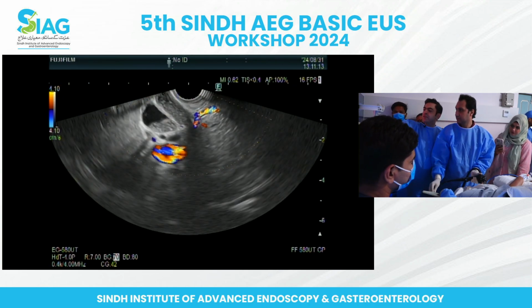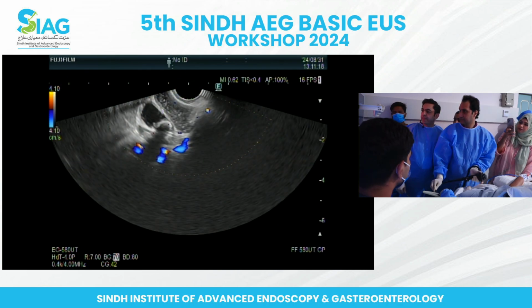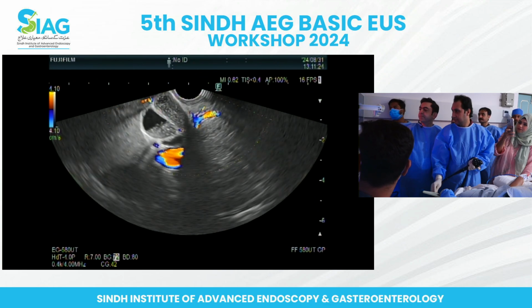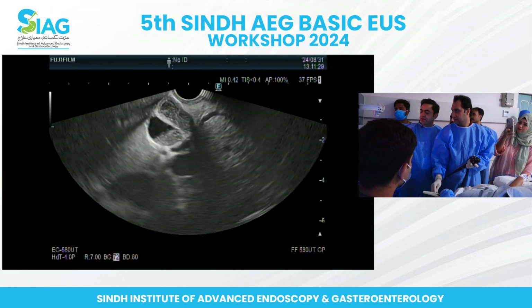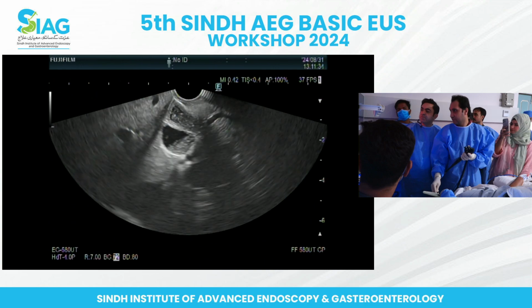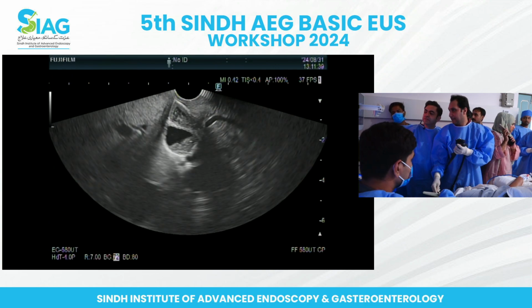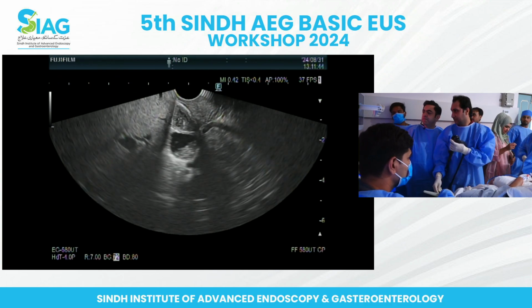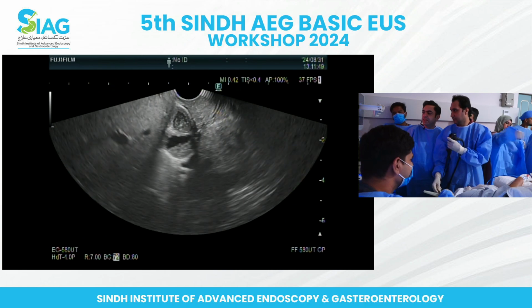Okay, so just follow the bile duct. Let's see if you can trace it all the way down. Khalid bhai, you were saying something? You're looking at it and just need to make sure that it's a bile duct or a gallbladder. So let's just follow it from the top to the bottom. Let's see if you can bring it down. With clockwise rotation, the way it looks, it's more like a gallbladder, not the bile duct. Yeah, you may be absolutely right. I think the amount of bile sludge it has is underneath.